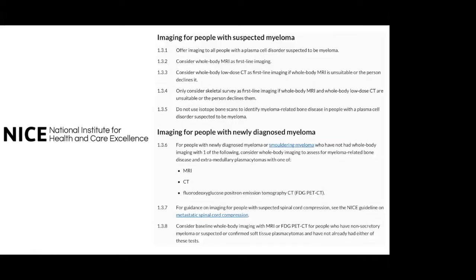And this is also reflected in the NICE guidelines, which at least everybody has heard of or knows exist. So in suspected myeloma, the first line imaging is whole body MRI, if not available, whole body low dose CT. And skeletal survey, if possible, should be avoided because we know it's inferior to all the other imaging methods. In newly diagnosed myeloma, again, a whole body imaging method, being MRI, CT or PET CT.